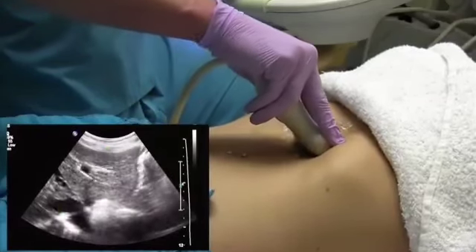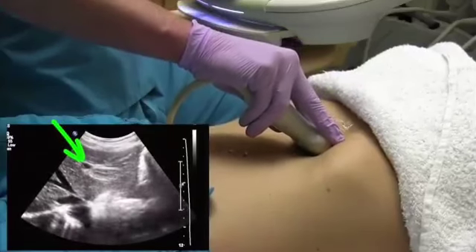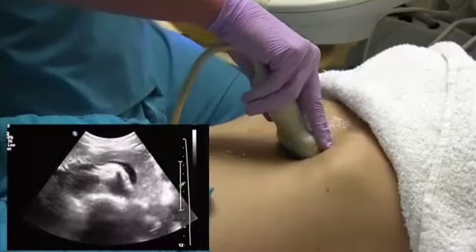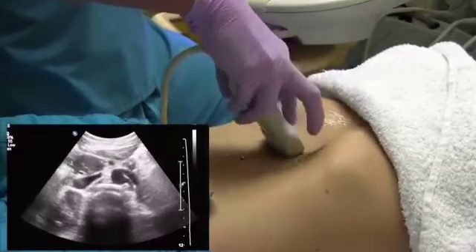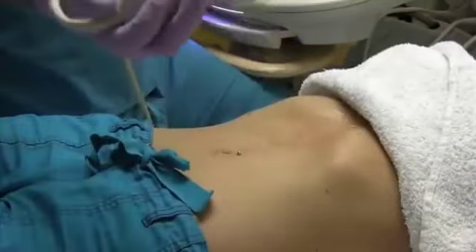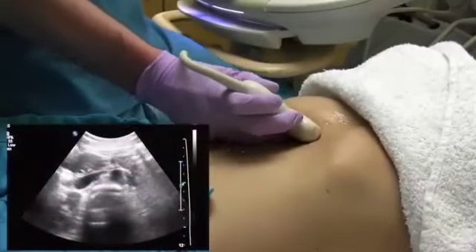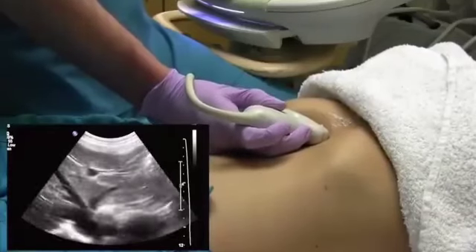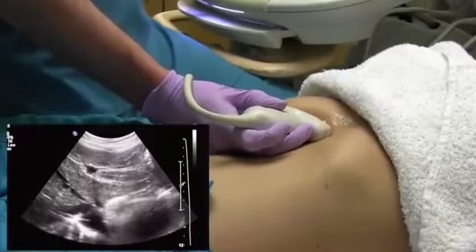And then last, you're going to see the portal veins. And you sweep all the way out of the left lobe here. You want to make sure you're sweeping through every organ, because if you don't sweep, you probably miss some anatomy and possibly some pathology too.